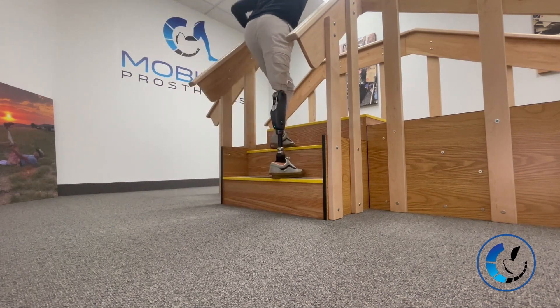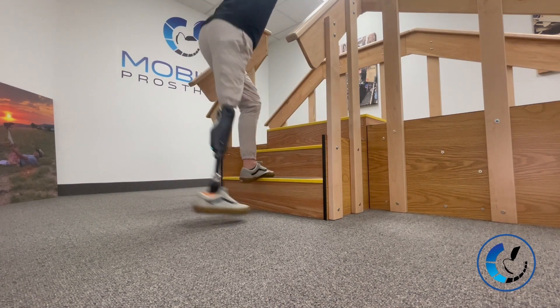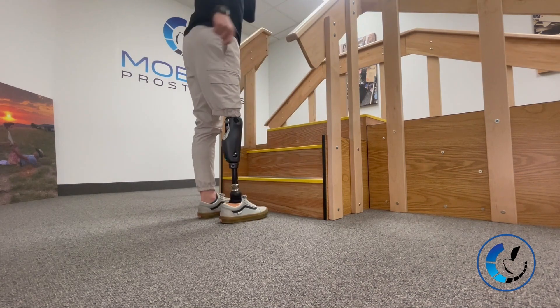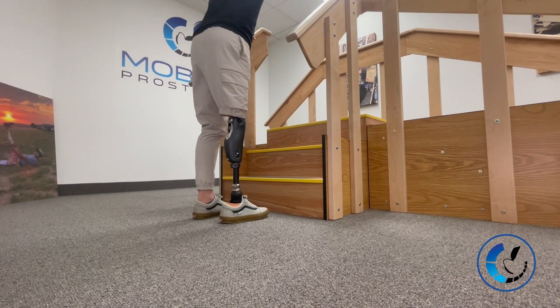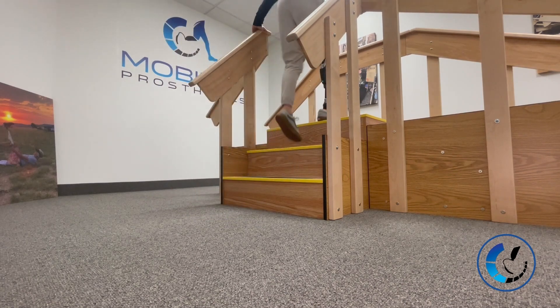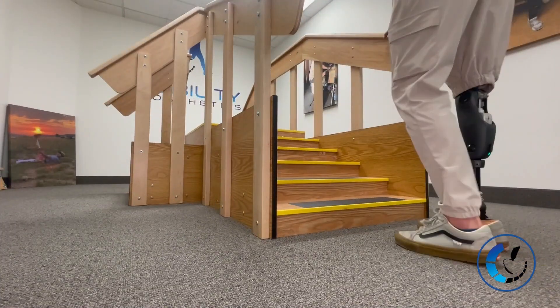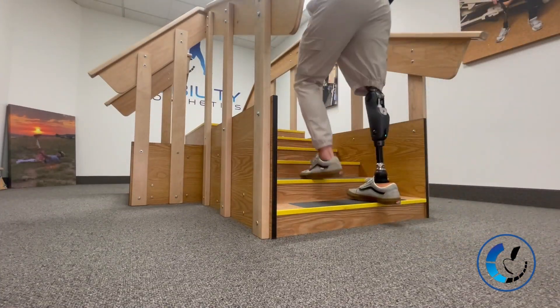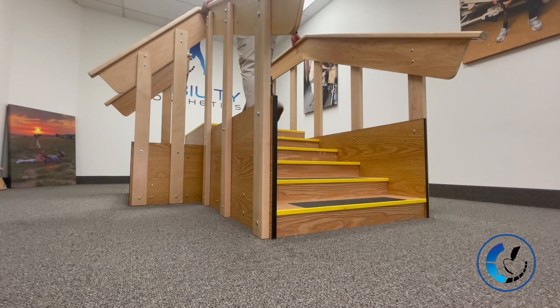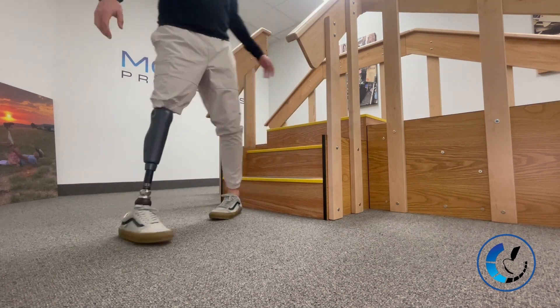Here we go into step-over-step stair ascent. After a little time wearing this knee, it does take an aggressive hip motion at that extension moment — you have to give it good feedback to get there. What I really like is that you can take the first step with your prosthetic foot without it needing to be on the ground to make it happen. You can lead with the prosthetic if you need to, and it's not too hard to do.